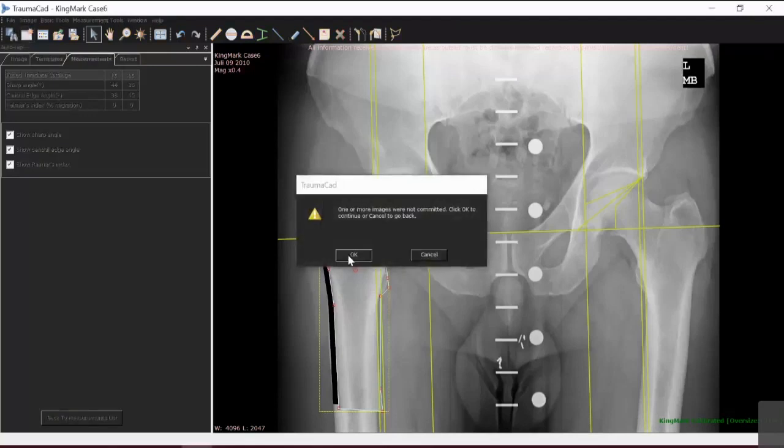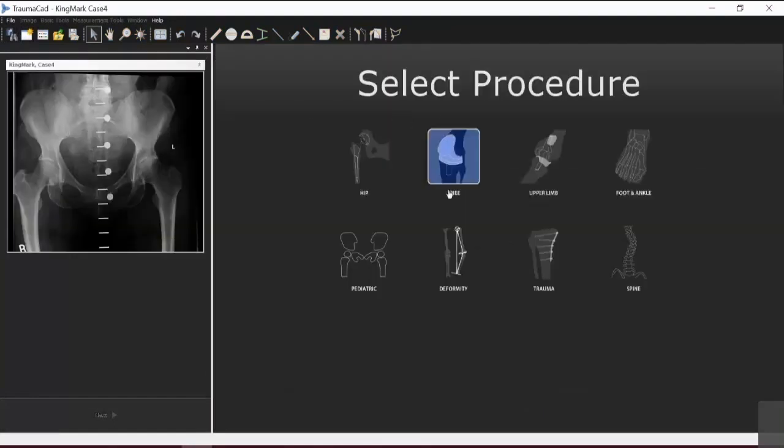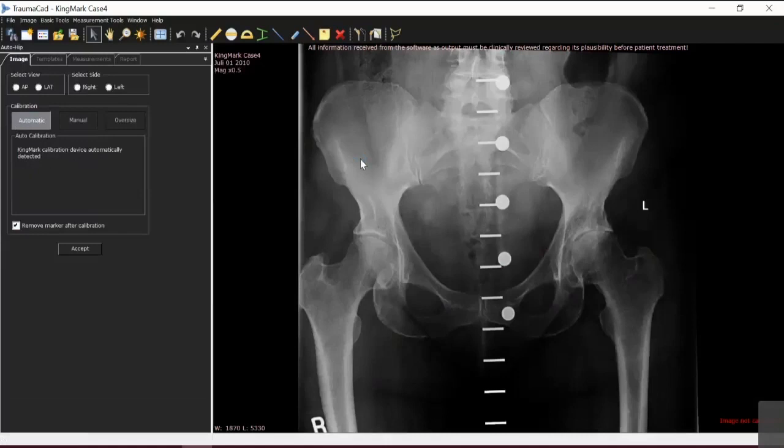As you know, radiographers, and this applies to lots of different countries, go through quite an extensive training. And part of their training is to identify the most appropriate, accurate view prior to surgery. So as an example, if we go back into the same case, the radiographic parameters for an AP pelvis prior to hip surgery, or even in any other case, is to take a view without rotation of the pelvis in relation to the X-ray table or the trolley, with the legs internally rotated by 15 degrees.